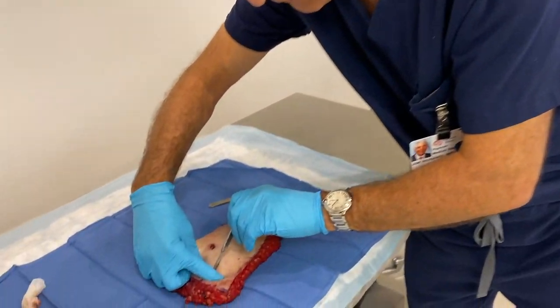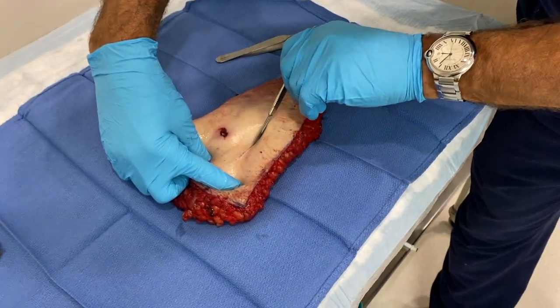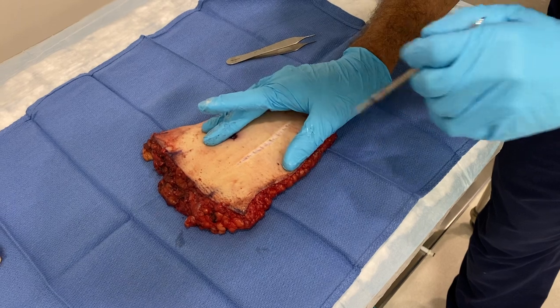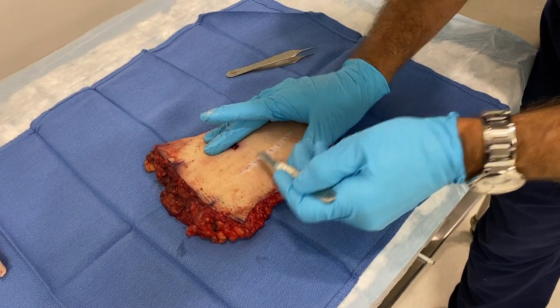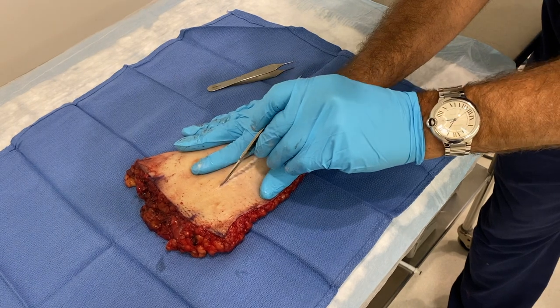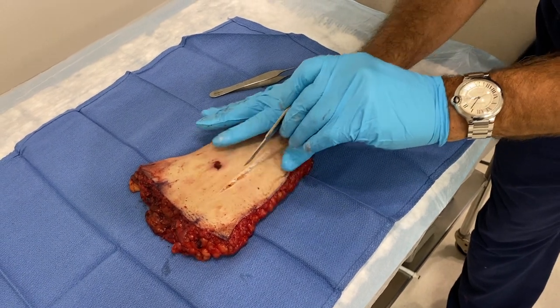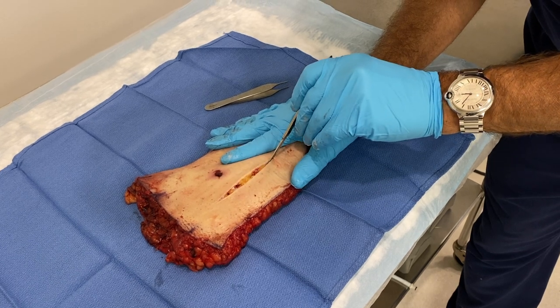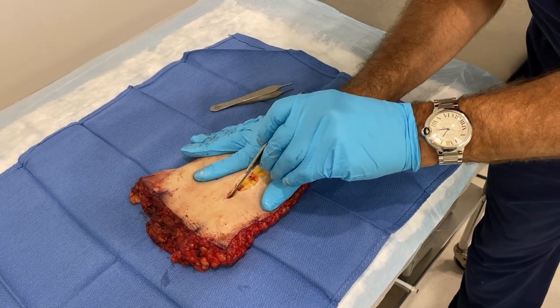First thing, we'll make an incision here. We can also use this tissue to practice. Here I've made an incision into the dermis. Now we're going to go a little deeper using the belly of the blade into the subcutaneous fat.